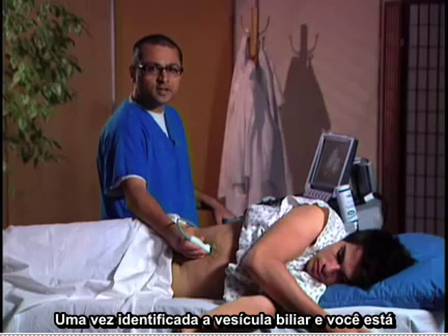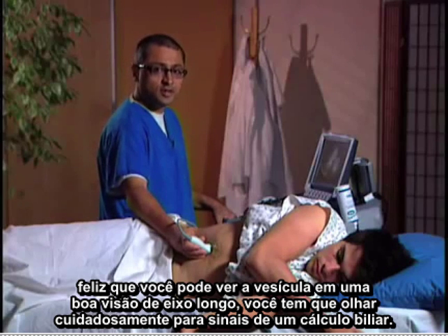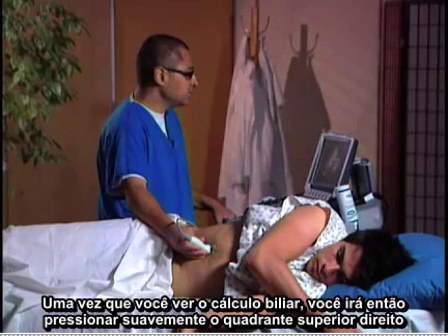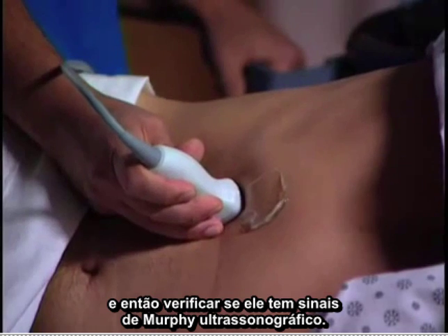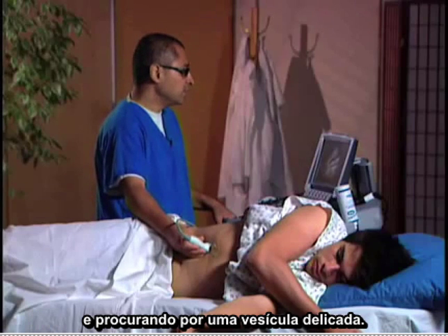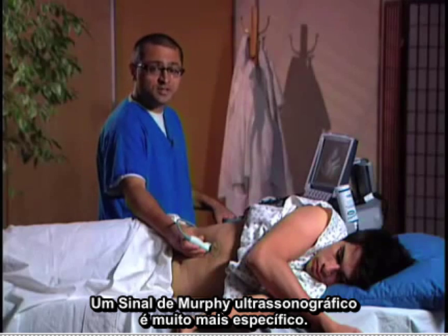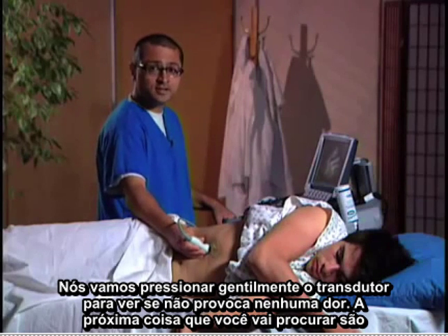Once you've identified the gallbladder and you're happy that you can see the gallbladder in a nice long view, you have to carefully look for signs of a gallstone. Once you see the gallstone, you're going to then press gently into the right upper quadrant and see if they have signs of a sonographic Murphy. We're all familiar as physicians with what a Murphy sign is, and that's palpation of the right upper quadrant and looking for gallbladder tenderness. A sonographic Murphy is much more specific, so we're going to press on the transducer gently and see if that elicits pain.